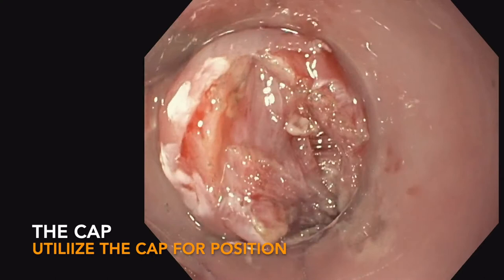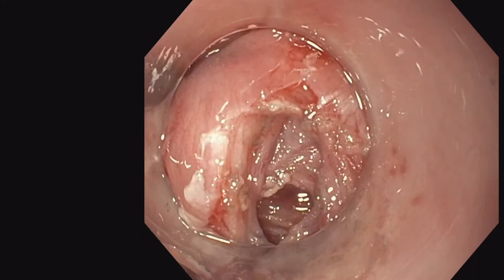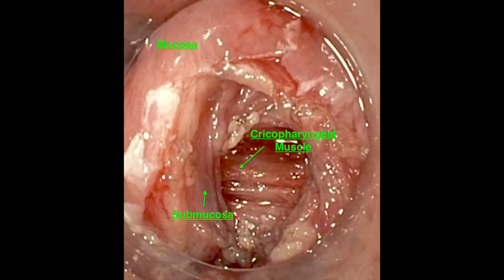Also, utilize the cap. The cap can allow you to separate these layers and provide better visualization, especially to get deep into that cricopharyngeal muscle or down into the base of the Zenker's pocket. Here you can see a very nice clear view of the different layers — the mucosa, the submucosa, and the exposure of the cricopharyngeal muscle.